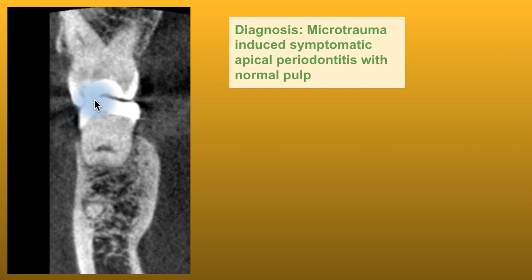As we can see here, this is a two-dimensional image of the 3D CAT scan. It's one particular slice in three-dimensional space. But you can see here there's no interference here, but there's definitely an interference, or at least a very intimate relationship between these two inclines. We've all seen wear facets on lower molars that look like this, and when they happen over a long period of time, patients adapt to it fairly well.